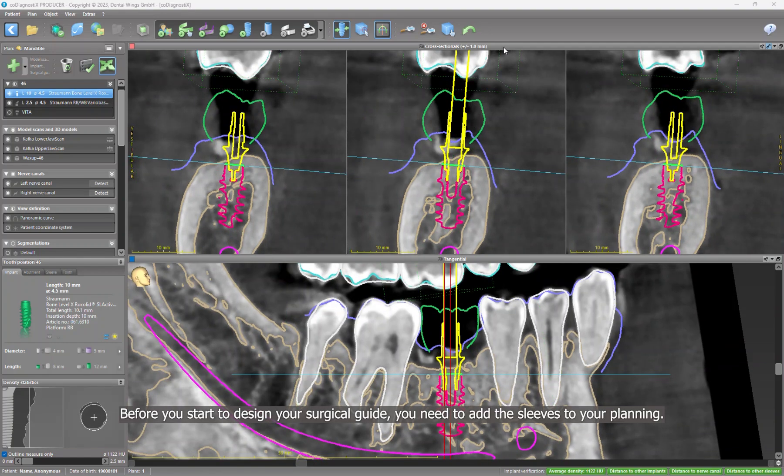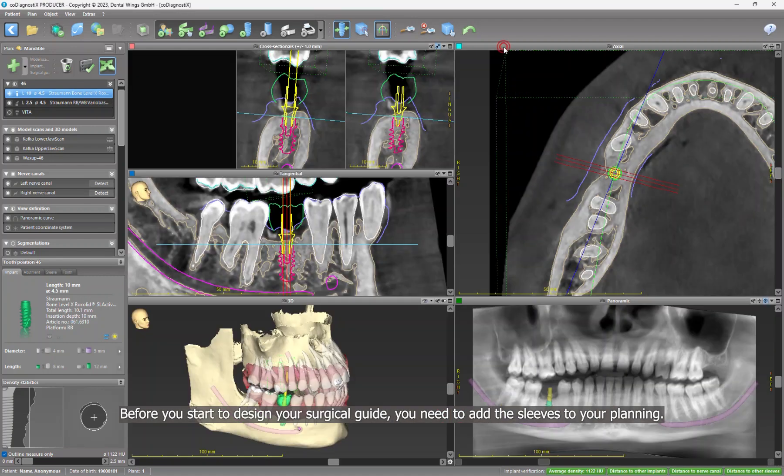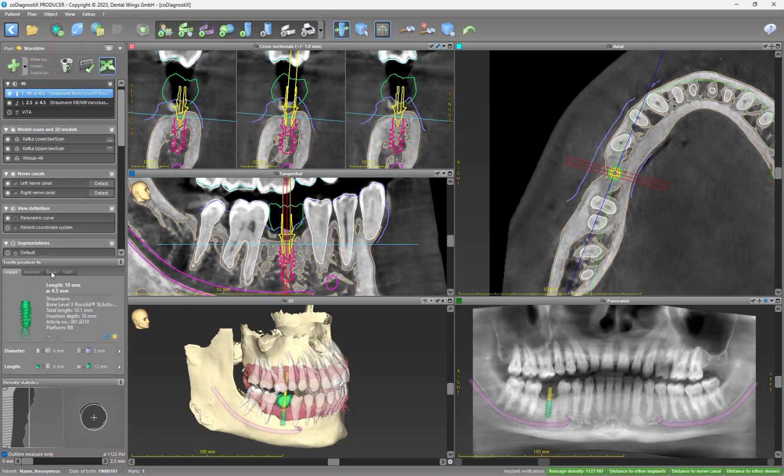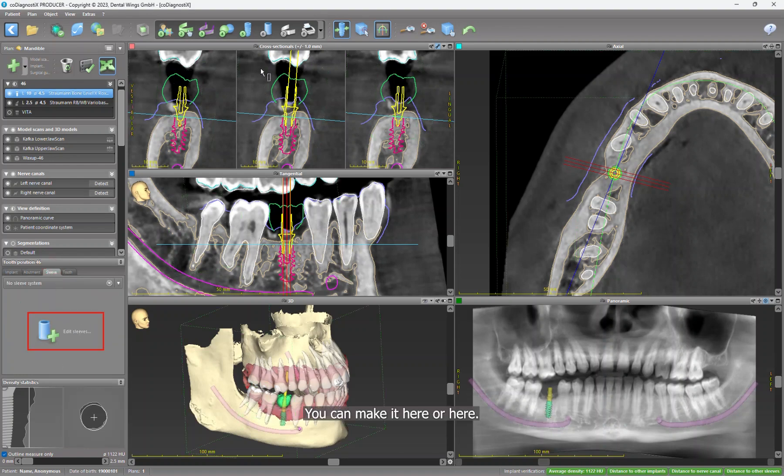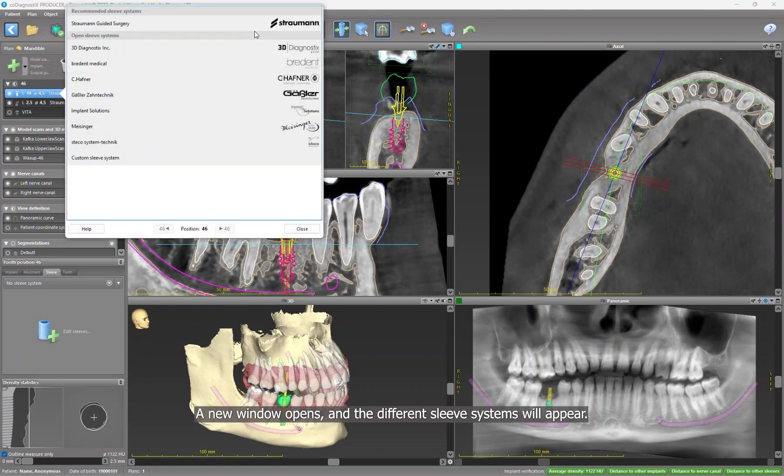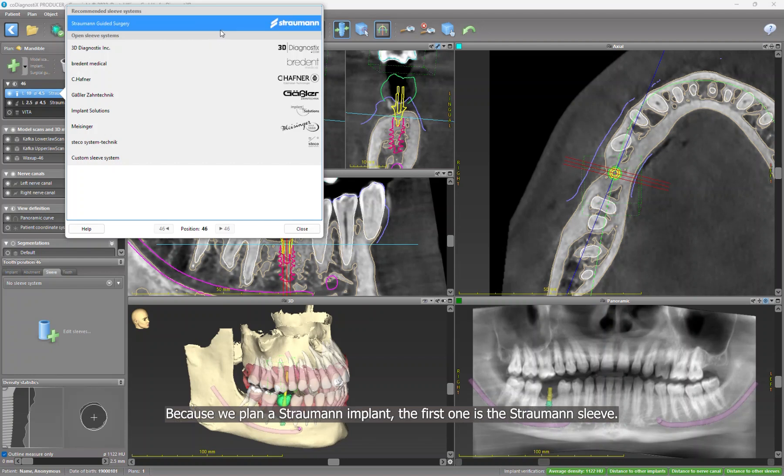Before you start to design your surgical guide, you need to add the sleeves on your planning. You can make it here or here. A new window opens and the different sleeve systems will appear. Because we plan a Straumann implant, the first one is the Straumann sleeve.